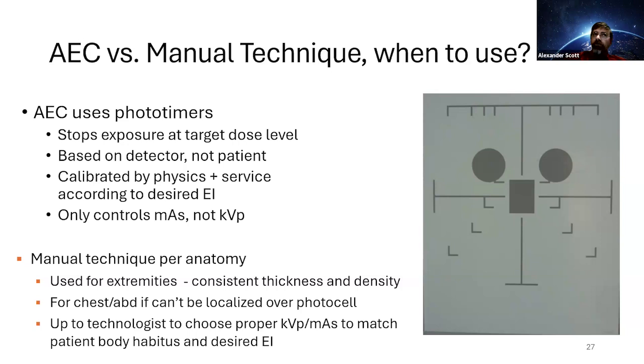And our inspector reviews those with us, to make sure that we have all of the attributes on there that are required. So in past inspections, we've had to add categories for small, medium, and large. We have to have the skin exposure for each technique, whether or not a grid is used for each protocol, and what is the target exposure level for each of those.